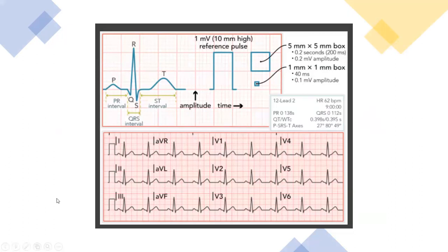This here I wanted to show you because it gives you a quick view of what the video talked about, and we'll watch that video in class. But for example, with these 12 leads, it'll show you that V1 is associated with where that lead's located. So it gives the physician or the cardiologist the ability to know, hey, there's damage in V1, so they can associate that with a certain part of the heart.